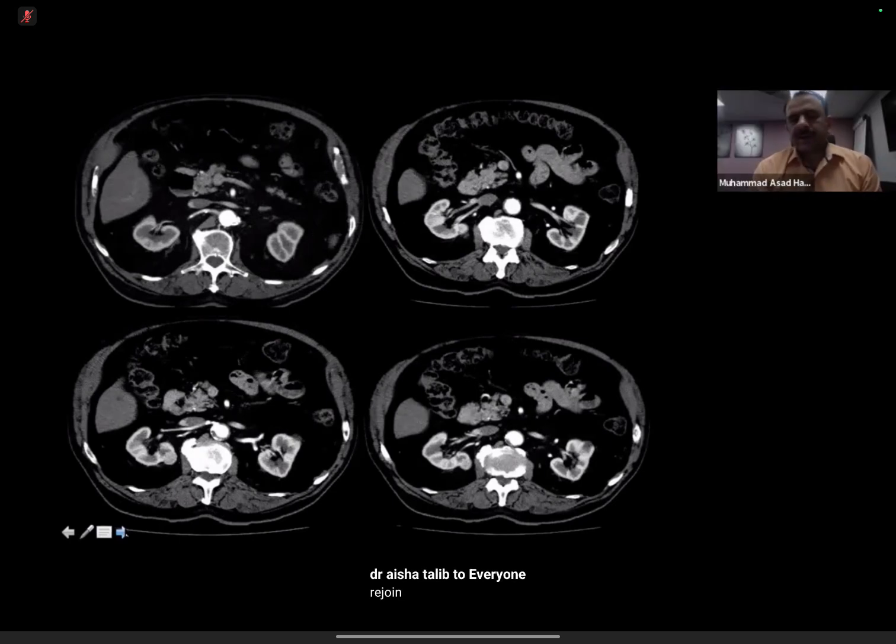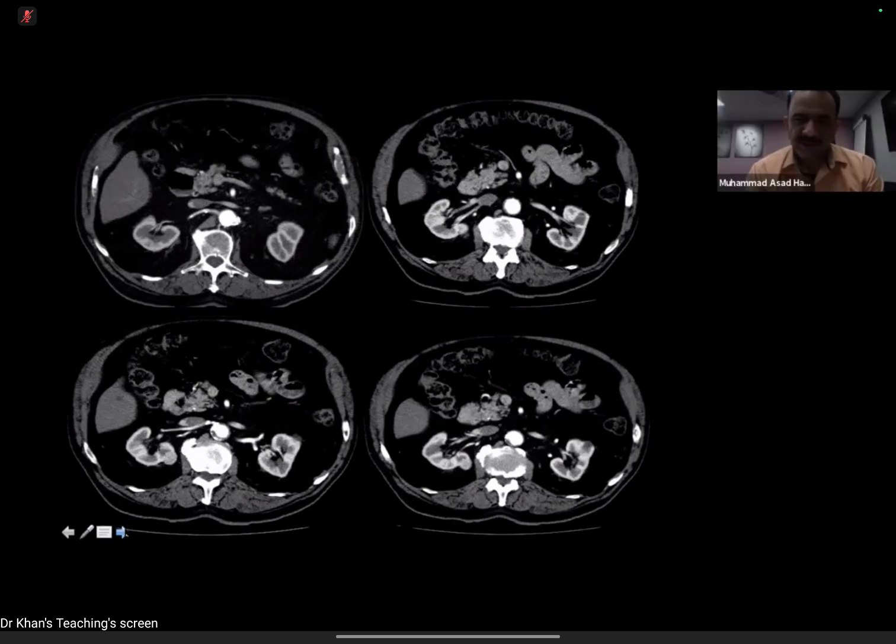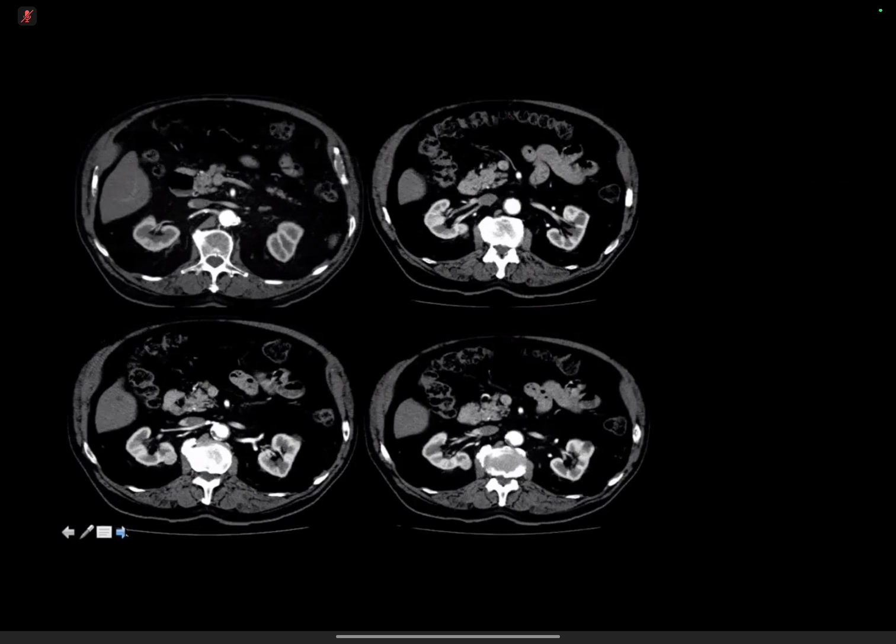Very good. So once you're describing to the examiner, first of all, you need to give your impression that it can be a potentially malignant lesion because of its intense enhancement. Okay. Recommending the biopsy and ablation. What sort of ablation would you recommend? There are different sorts of ablation for this lesion. We can perform cryoablation, and we can also perform RF ablation. It's not a central lesion. There is no big fear about injuring the ureter or the renal vessels.